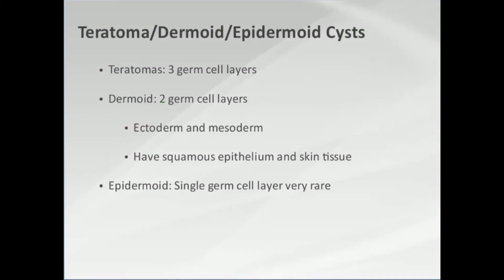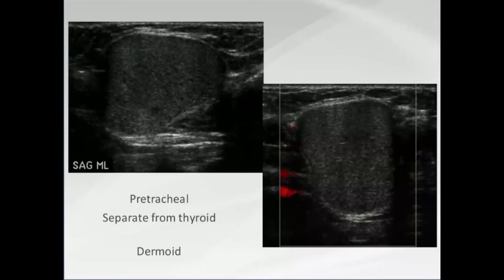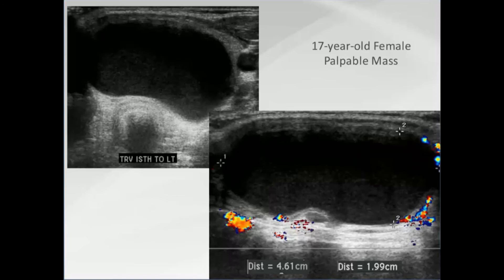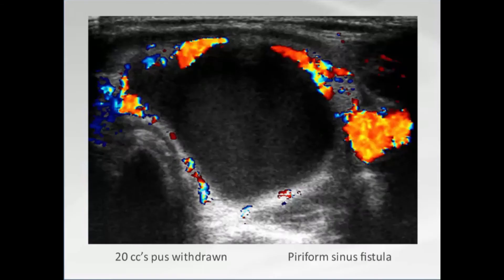Teratomas are one of the terrible T's that can happen in the superior mediastinum and can also be seen in the neck. Teratoma, dermoid, or epidermoid are defined based on how many germ cell layers they contain — that's a pathology diagnosis, not a sonographic one. Here's a pre-tracheal lesion, separate from the thyroid, very homogeneous, that could have been ectopic thyroid tissue but turned out at pathology to be a dermoid. A 17-year-old girl with fullness in her left neck had a five-centimeter complex cystic lesion — possibly a branchial cleft cyst or lymphocele.